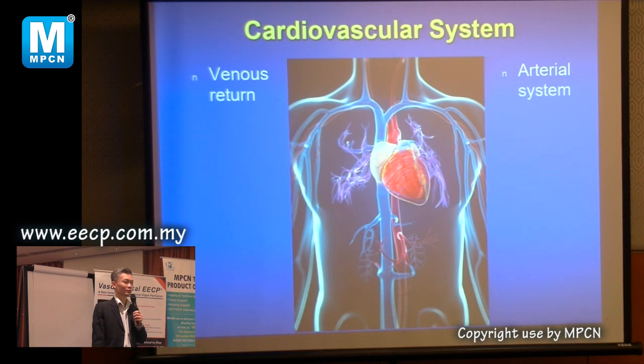There are a few things to watch out for, but you can predict by just one glance at the patient. When they come in walking breathless with leg swelling, cannot do. You must send them to the doctors first. Make sure their lungs are clear before you do. So you understand? Yeah. This is just a general principle.